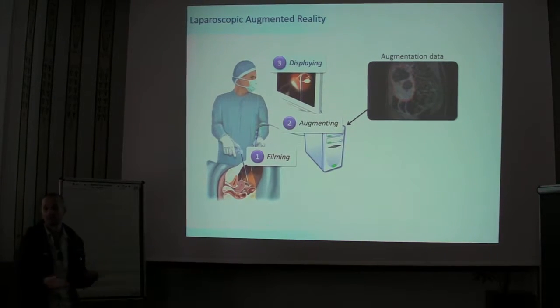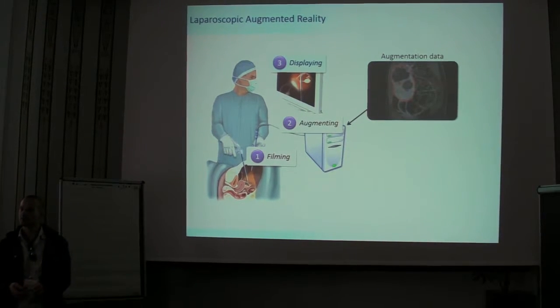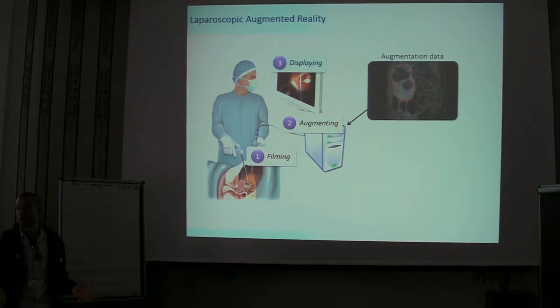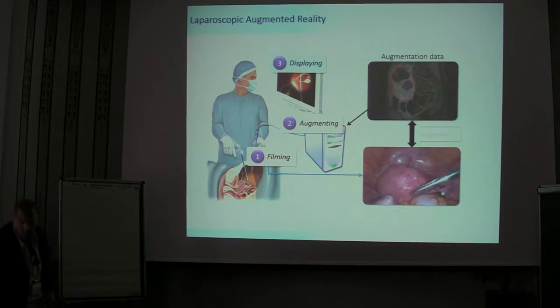It's actually quite funny, at least in France, the radiologist makes the MRI, and then he makes some report to the surgeon. It says, my dear colleague, I found that many tumors, but it doesn't say how big they are, where they are, etc. And many of the surgeons don't look at the MRI. They do ultrasound because they do it by themselves, but in ultrasound, you can't see this type of tumors that well. So anyway, we thought that this was a very good opportunity for AR to try and augment this data on the laparoscopic image in real time.